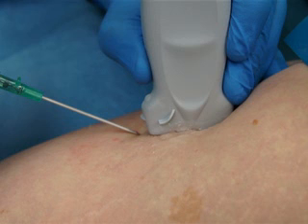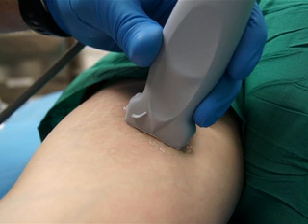The longitudinal or in-plane approach provides good visualization of the needle tip and vein, but it does not allow simultaneous visualization of surrounding structures, so always evaluate the anatomy transversely before attempting the longitudinal technique.